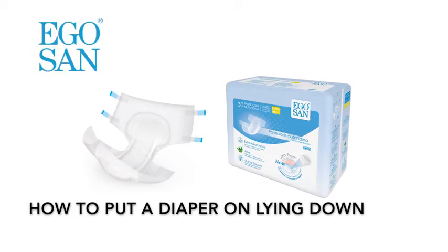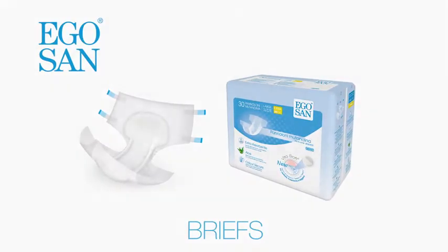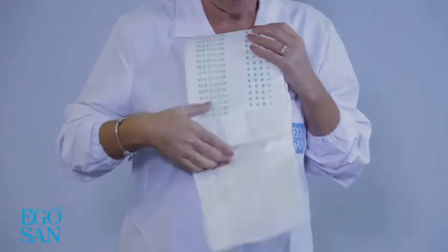This video describes how to put on EgoSan briefs in a lying position. Make sure you have chosen the right size and that the absorbency is suitable for your incontinence level.